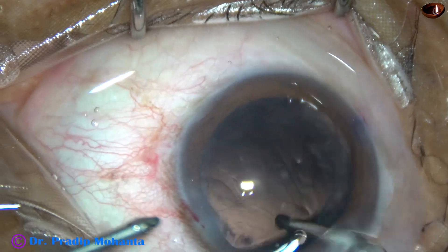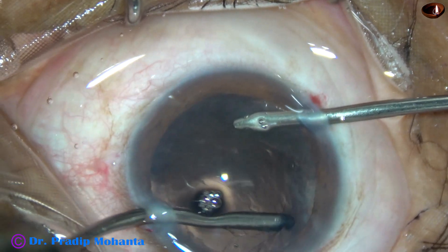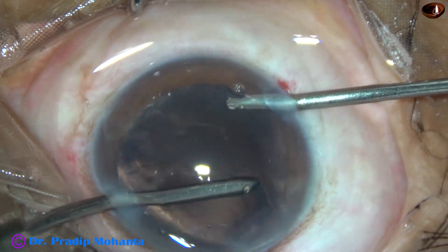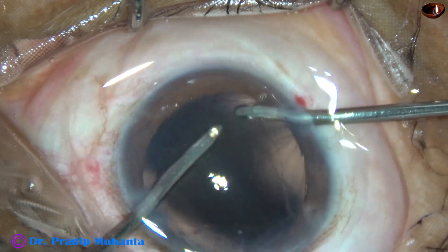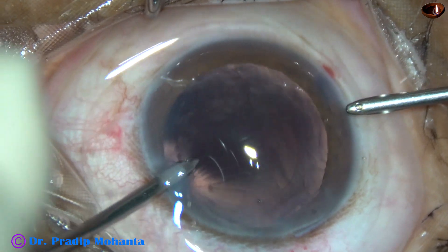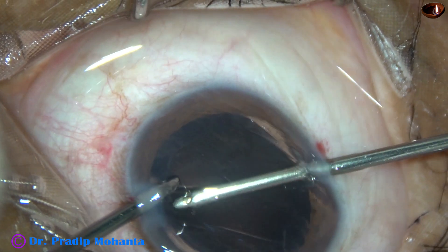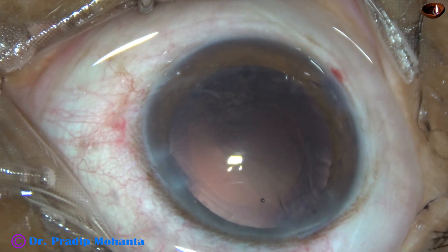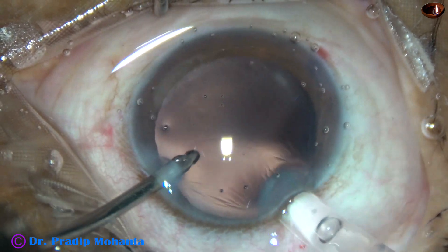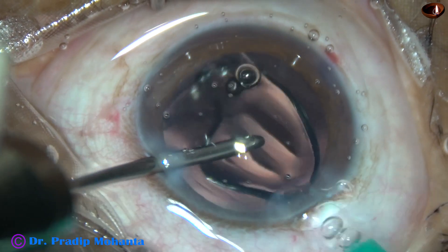Each nuclear piece is emulsified and it gets vanished in no time. Now I am going to use bi-manual irrigation-aspiration for removal of cortex. Irrigation is from the right side port, aspiration from the left, and all the cortex from the right side has been removed. Now the cortex from the left side is being removed. All the cortex has been removed. Some fibers are there here and there that will come out when we polish the capsule after implanting the intraocular lens.